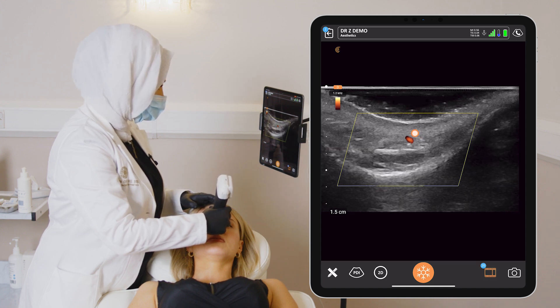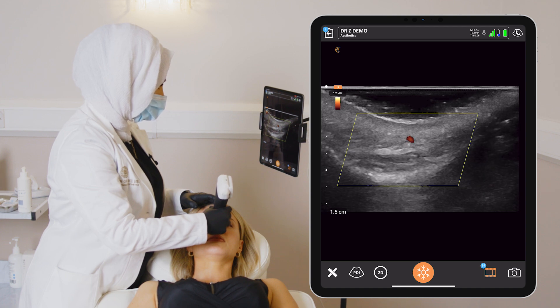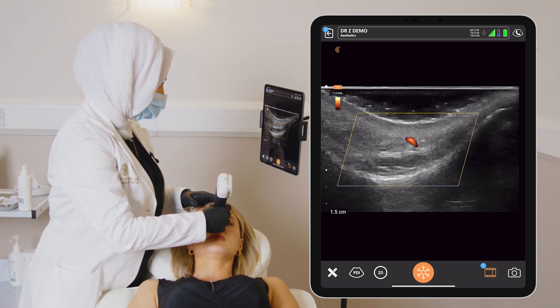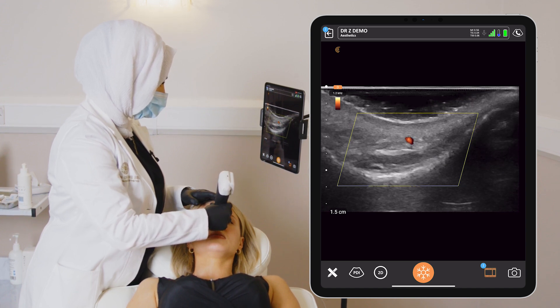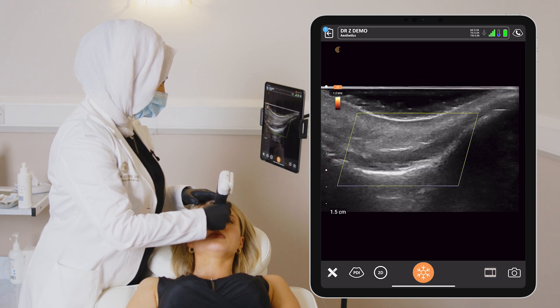We can see the vessel in the superficial fatty layer, which is exactly where we want it to be so that we can inject on the periosteum. I'll stay scanning just for a few minutes, making sure I'm happy with the trajectory of that vessel, tilting the probe in order to help me follow the course of this vessel while we're in this sagittal view.